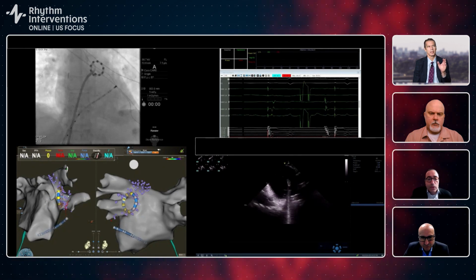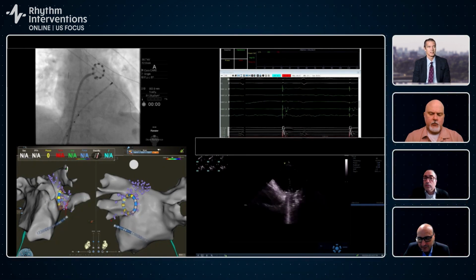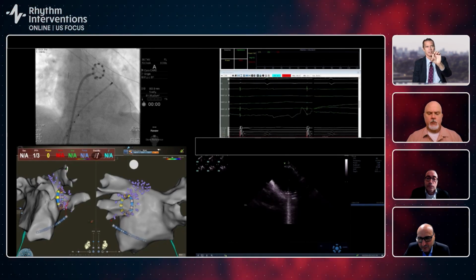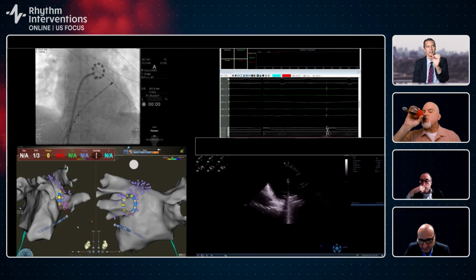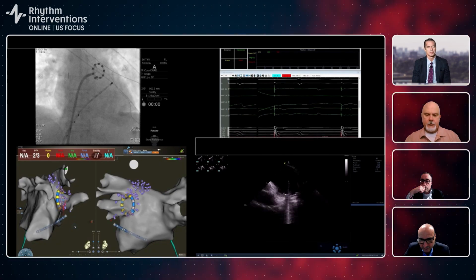No, since you're killing this, I'm going to ask you now, because let me just quickly finish the comment. It kind of makes a coin slot orientation, this catheter at times. Can you talk a little bit about that compared to the other PFA catheters, and how you avoid that getting, I think, flush with the ostium?